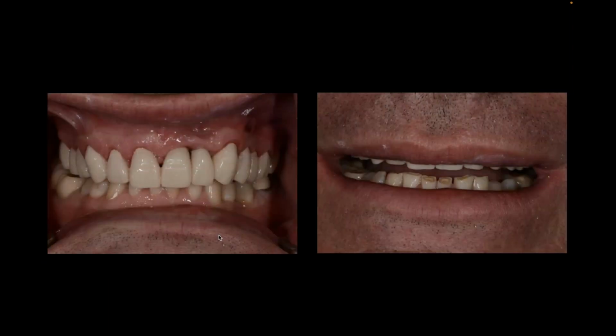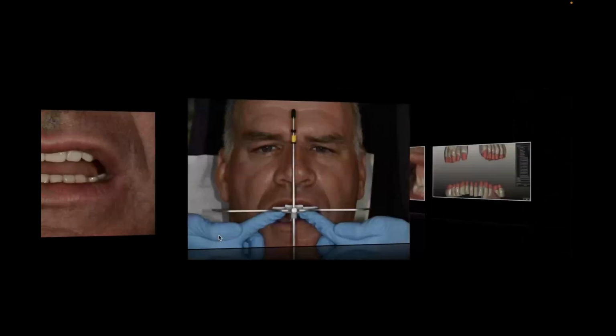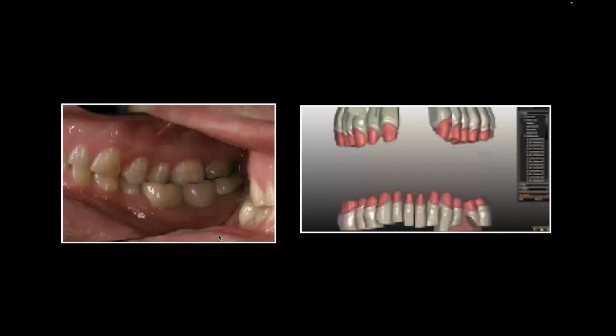We'll provisionalize the patient, transfer that new provisional with another analyzer or another Facebow, so I'm making sure that everything I'm seeing is level on my articulator. And then I can come back, and this was one of my first digital cases all these years ago, back in 2008 or 9. So you can even see the old digital programs, right? How funny they look.